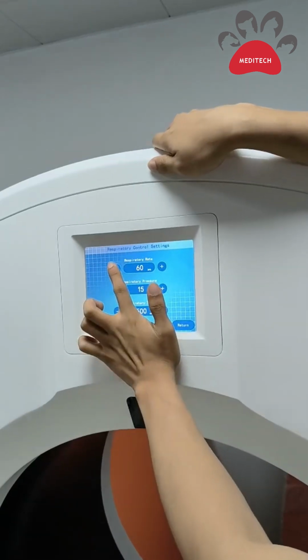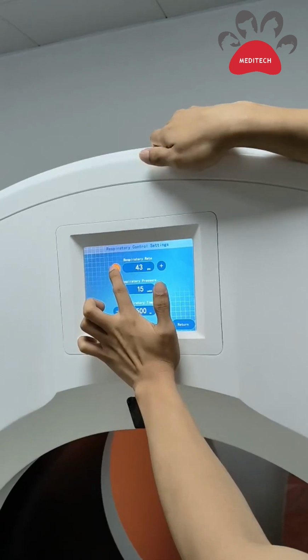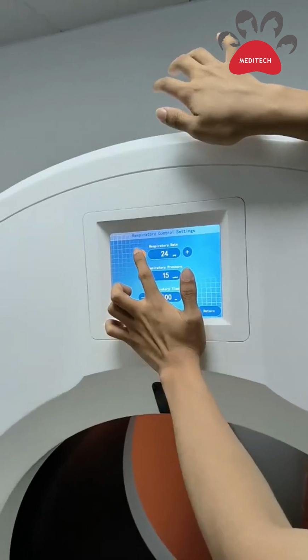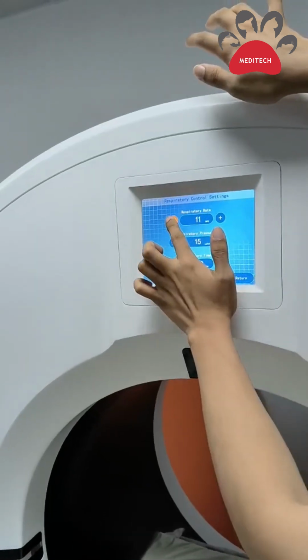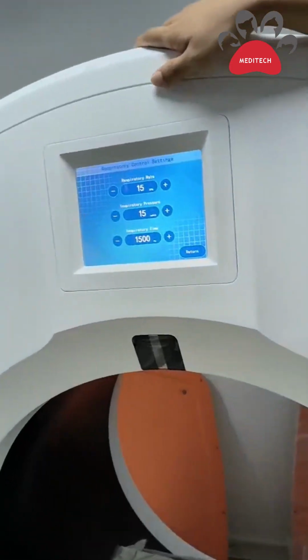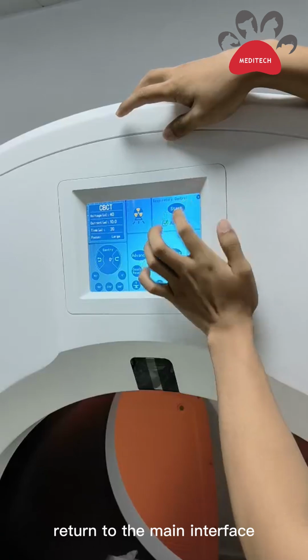Generally set the respiratory rate to 8 to 10. A little fast for 15. OK. Return to the main interface.